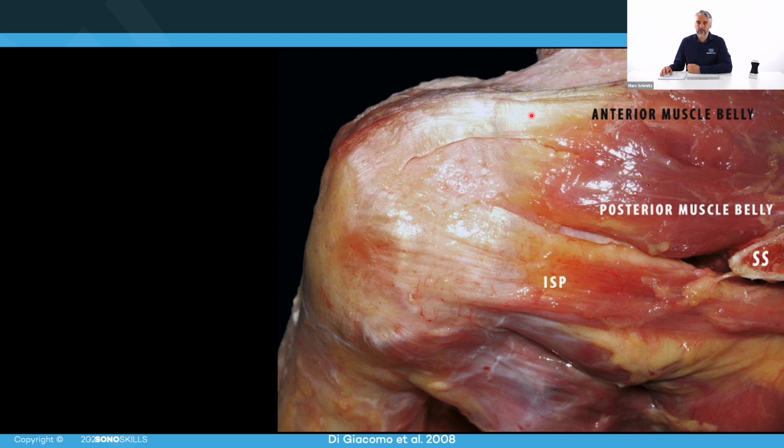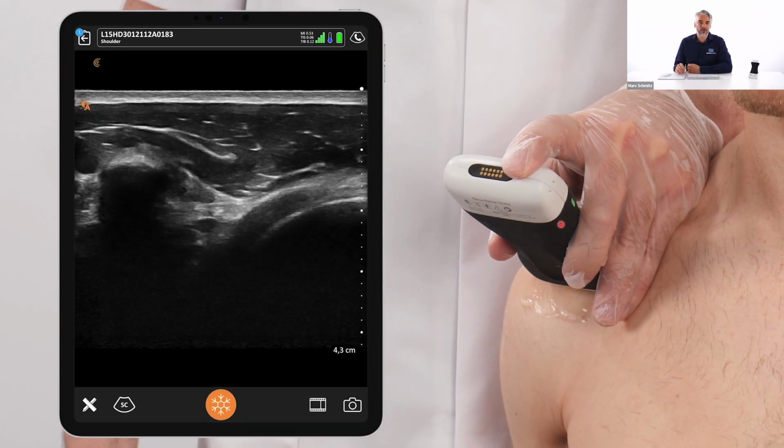So this tendon within the muscle is really important to look at if you want to search for fatty infiltration or atrophy of the supraspinatus muscle. In many cases, and maybe the first go-to in hospital settings, is MRI to search for fatty infiltration of the supraspinatus muscle. But I would say that ultrasound is also something you can use to assess fatty infiltration. And I think it's especially helpful if you're working in primary care or you don't have access to MRI. It really helps you in understanding, should I refer this patient to an orthopedic surgeon for maybe cuff repair, yes or no? So I'm going to show you later on.